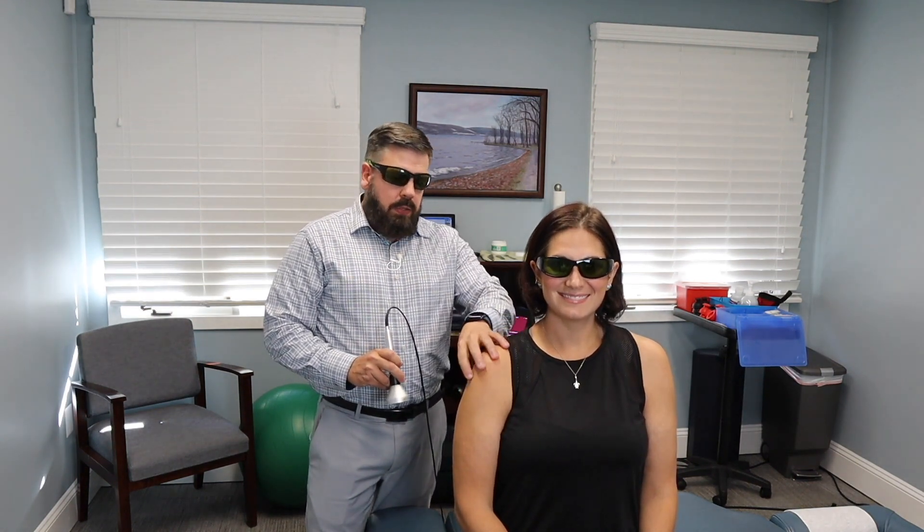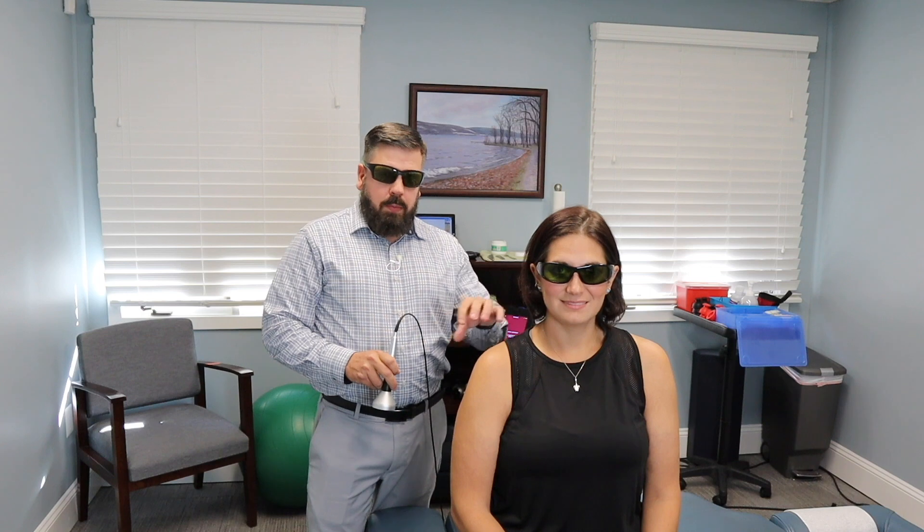To relieve pain and inflammation in the shoulder, we're going to use laser therapy. It penetrates deep into the joint to calm down the irritated area and provide pain relief. This is great because it's a conservative, non-invasive way to relieve inflammation. You could get a cortisone shot, but you're limited to three shots, and studies show it can cause premature wearing down of the joint and damage to the tendons.